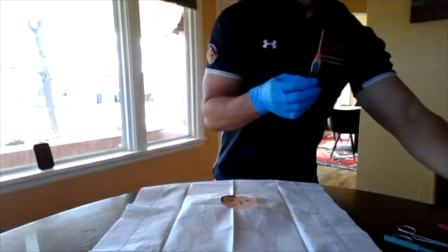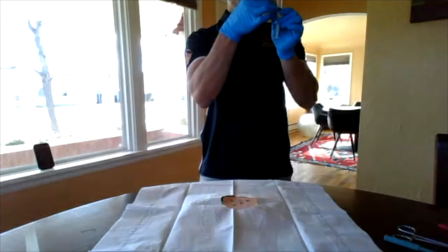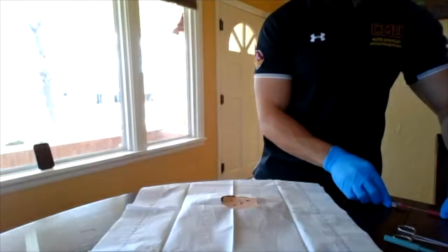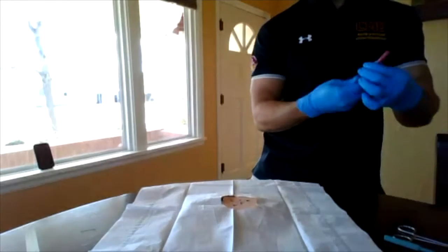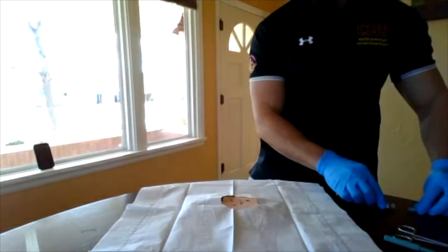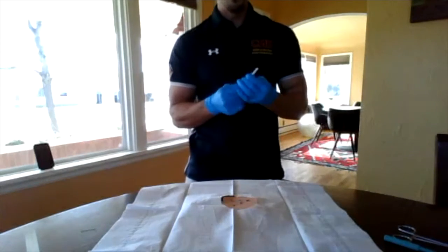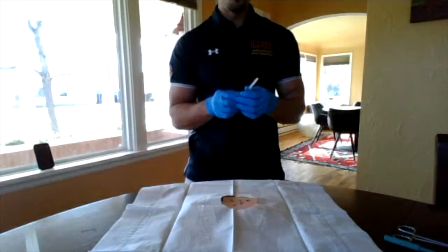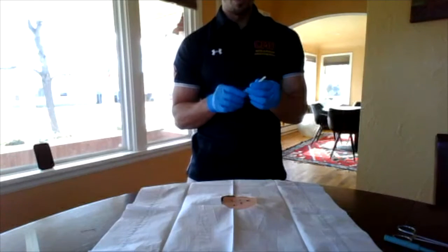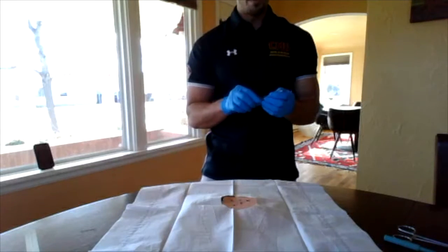All right, so now that we have this, we will shake out all the bubbles that may be in there, and then we'll recap our blunt needle. Remove it, and then we'll place on our 30 gauge injecting needle. So at this point, you want to inform the patient that they may experience pain with the injection, but that you're nerve blocking the area with lidocaine with epi.